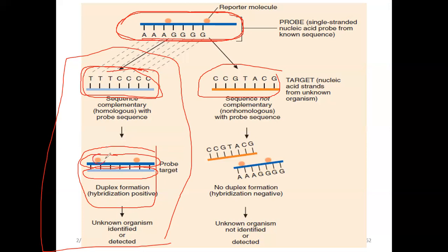Then, finally, okay, we read the result. If gumamit tayo, guys, no, ng fluorochrome, then we use the results of fluorescence microscope. Okay? And eventually, kunwari, ito si probe for E. coli strain 0157. Okay? At nag-form sila ng duplex. Okay? Ibig sabihin, pag niread mo siya sa fluorescence microscope, after washing, matitira, okay, yung probe mo kasi nakafix na siya with your target nucleic acid sequence. Okay? So, kahit mag-wash ka, hindi matatanggal kasi nakafix na siya dun sa nucleic acid sequence sa specimen mo.